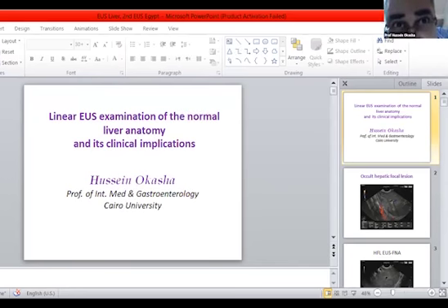Yes, very nice questions. We started our prospective study, as I told you, 5 to 6 years ago, and EUS missed about 1% of liver metastasis. The problem in EUS is that it can't see segments 5 and 6 properly.